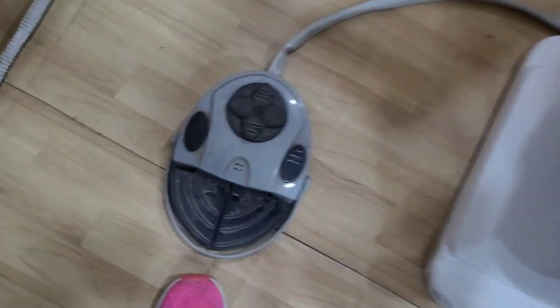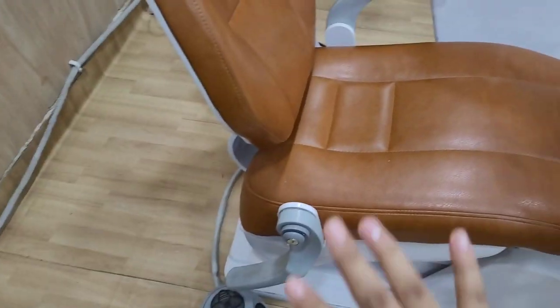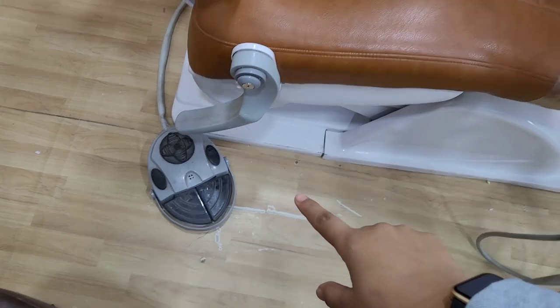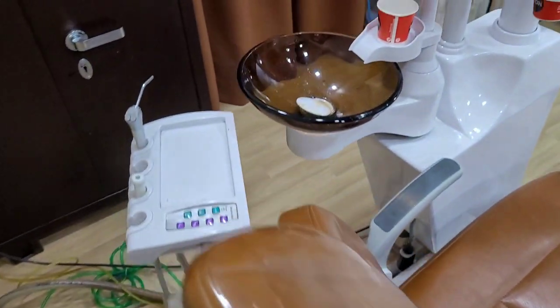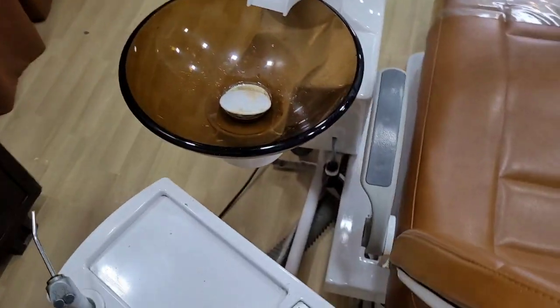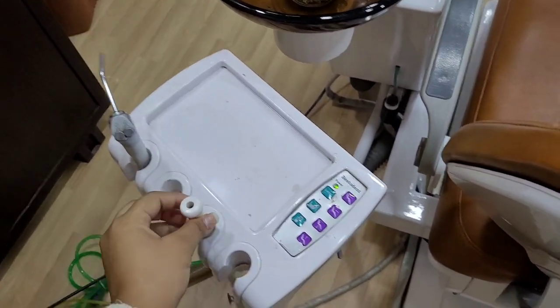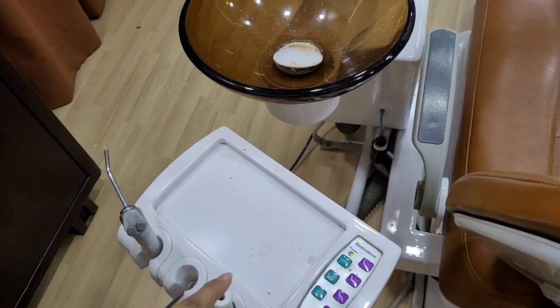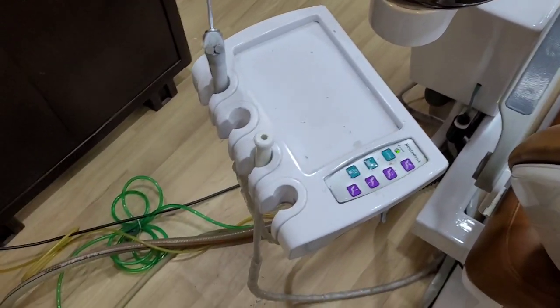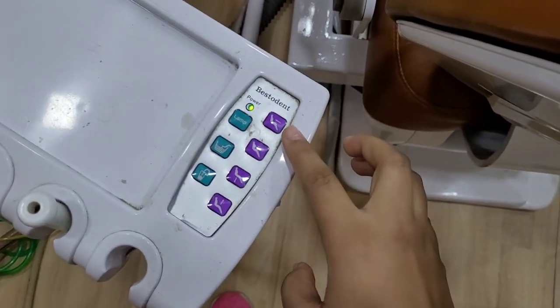The air rotor is also labelled along with the micromotor. We press the air rotor button to activate it. Now on the other side where the assistant sits, there is a suction with a different tip — it is disposable and we discard it after each patient. There is also a 3-way syringe with the same buttons on this side.